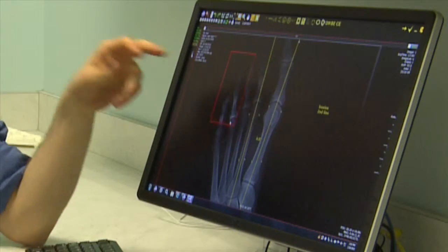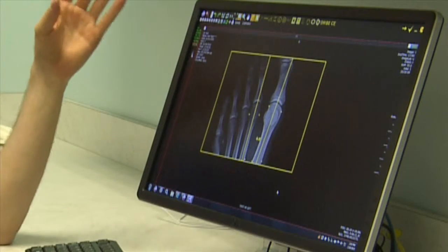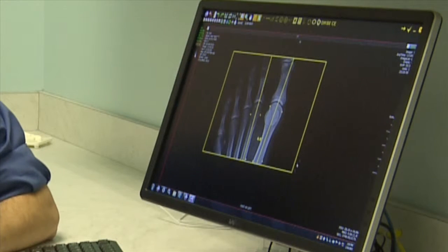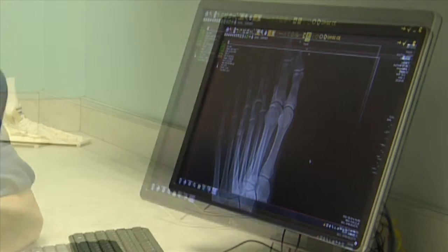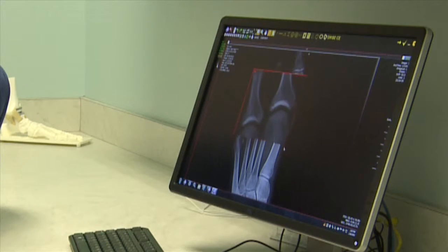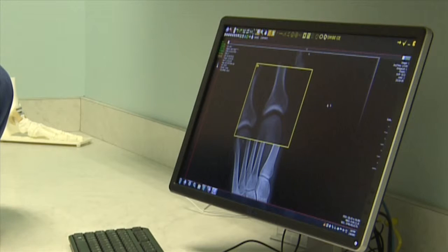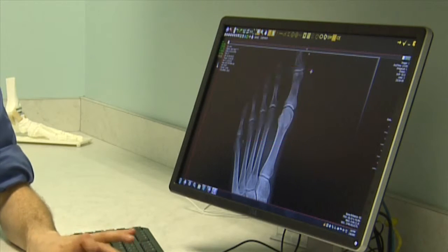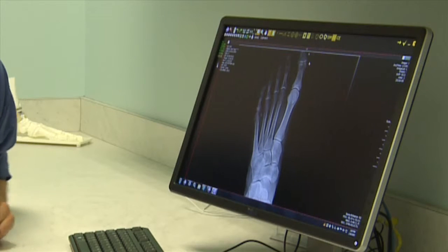Shutter box: click on one corner of where you want to shutter and then another. It's kind of a crop, but keep in mind everything in this viewing software is just an overlay — we always have the original image. You can grab it, delete it, make an adjustment, or hit Delete All Annotations to clear everything. Auto Window Level adjusts contrast to the region of interest you select — you won't use that as much, but now you know what it is.